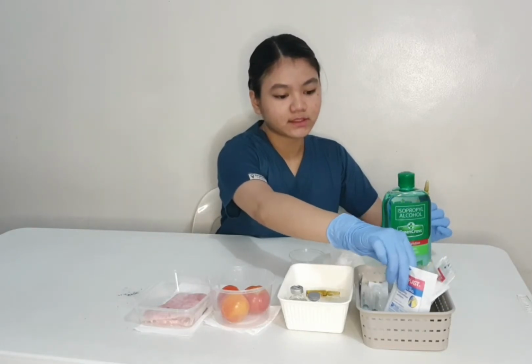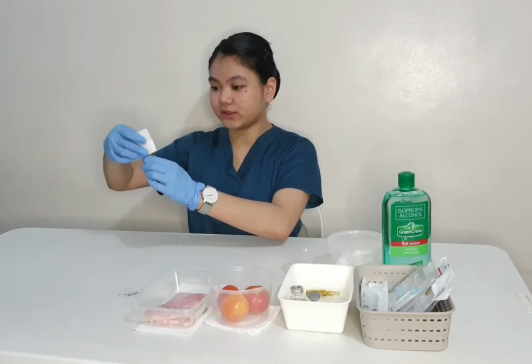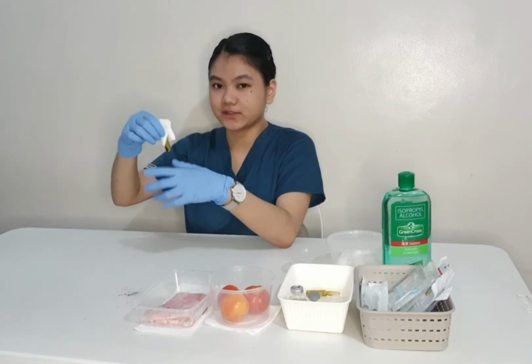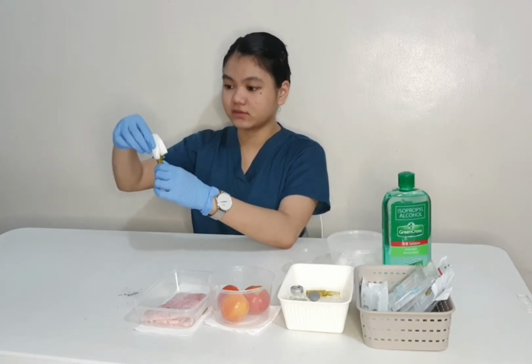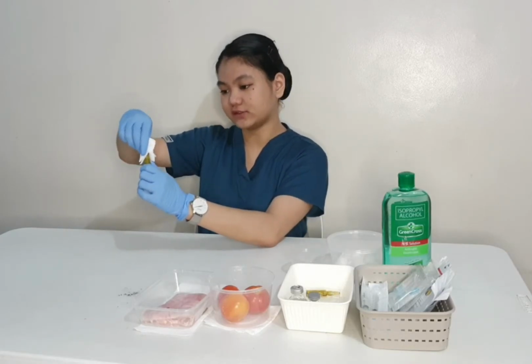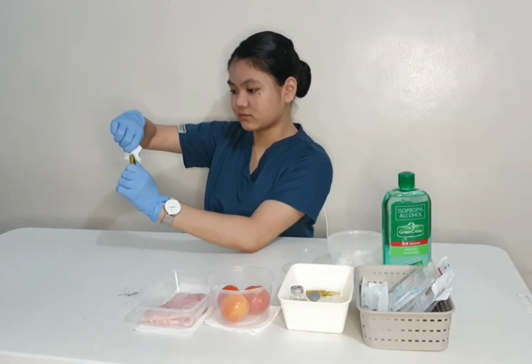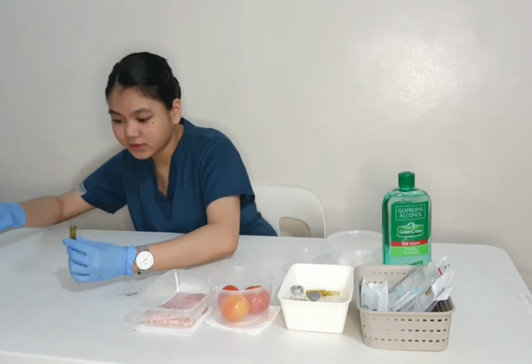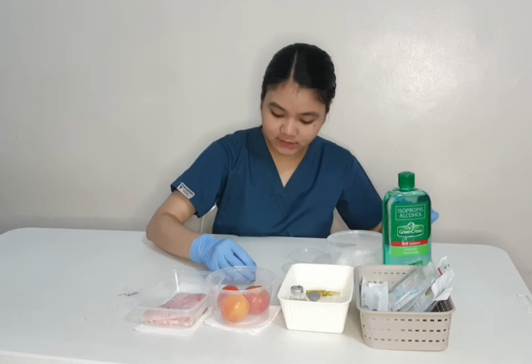Then after that, let's get a gauze pad or cotton swab to open the head of the ampule, and we must be careful so that we will not get injured by the glass particles of the ampule. When we break the head of the ampule, we have to push it towards the outside, away from us, and break it. There you go. And then throw it in the proper bin. Then after that, let's just put it here.